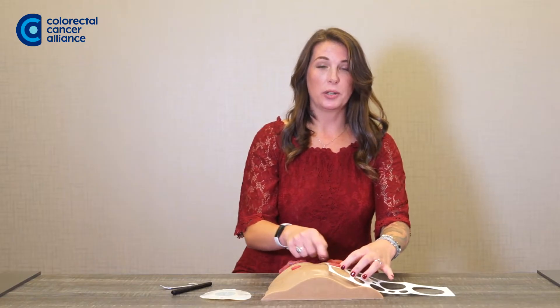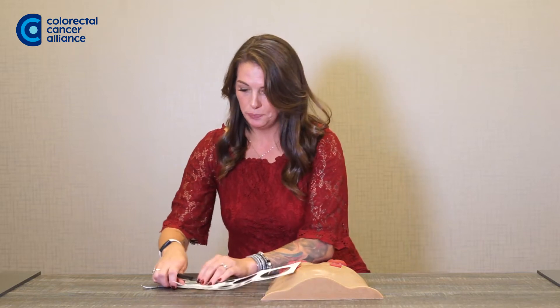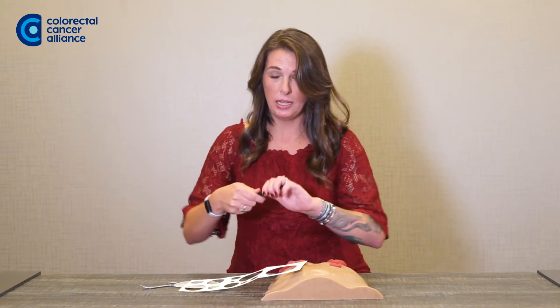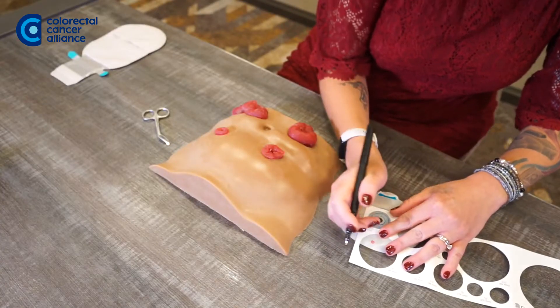Once you've found the correct size of your stencil, you're going to bring it over to your wafer, use the pens that they've also provided, and trace it.